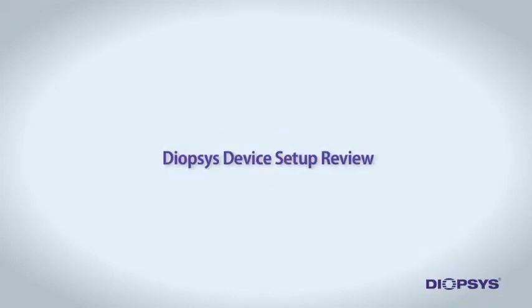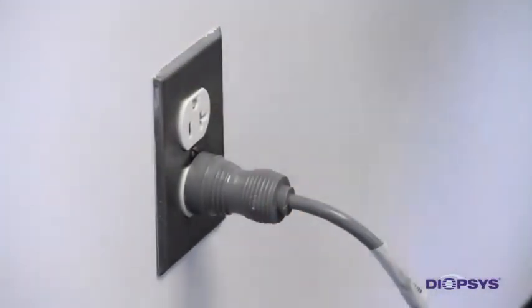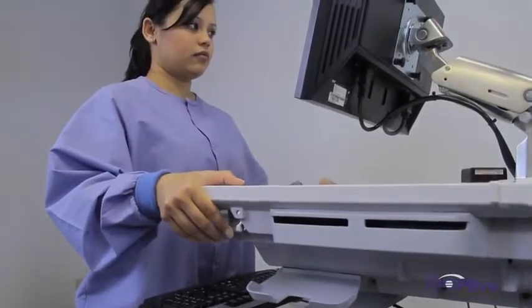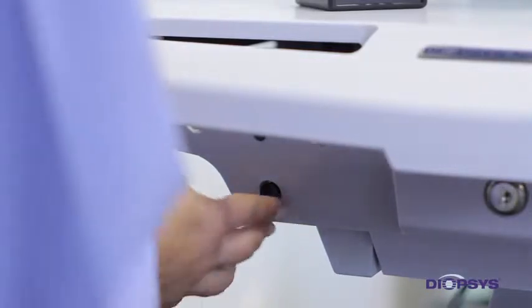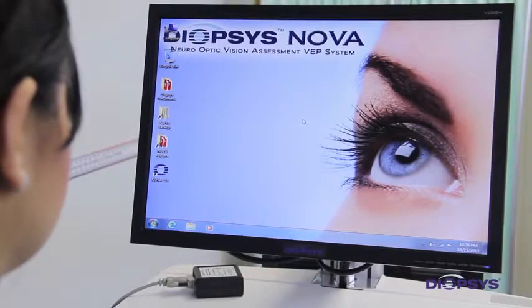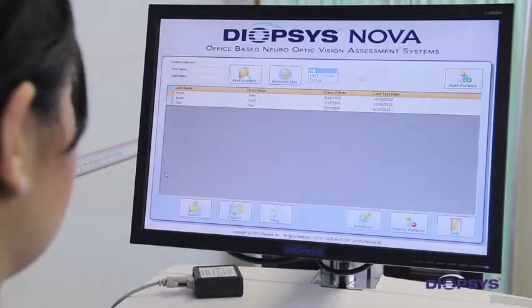Before testing patients using the Diopsis NOVA Vision Testing System, we will review some of the features of the device. First, you must plug the device into a dedicated, properly grounded power outlet. Next, you may adjust the height of the operator's tray to your height for comfortable viewing of the screen and ease of use of the keyboard and mouse. To turn the device on, press the black power button located just beneath the left side of the operator's tray. Once the device has successfully started and the operator's monitor is on, double-click on the NOVA icon on the desktop. This will open the NOVA Vision Testing program.